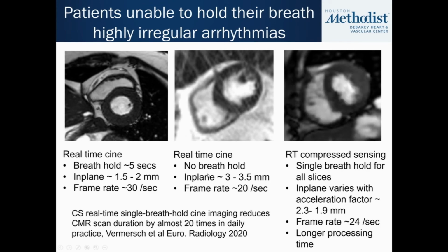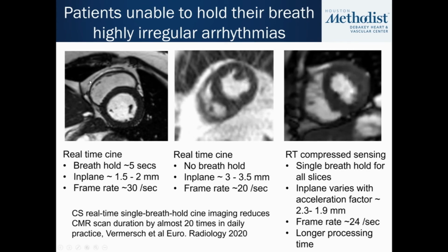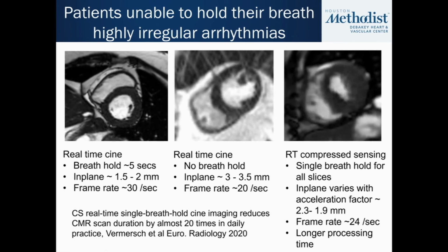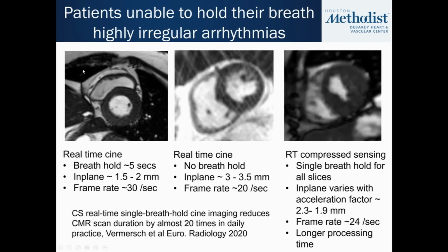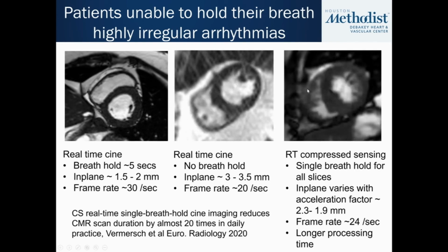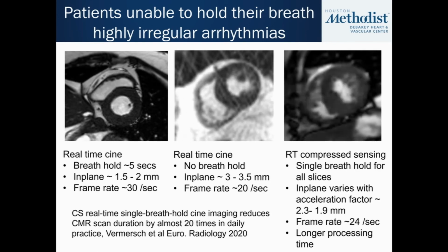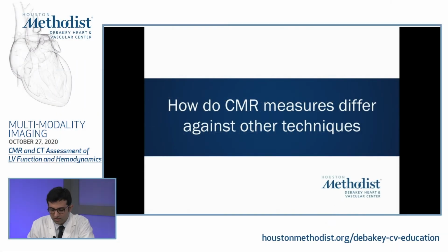A lot of patients, particularly those that we're tracking closely for minor changes or for whatever reason you want to have the best quality, we're still going by the gold standard. But this is a very good option for those who can't hold their breath or have significantly irregular arrhythmias. There's multiple other ways, but I won't discuss that as extensively here.